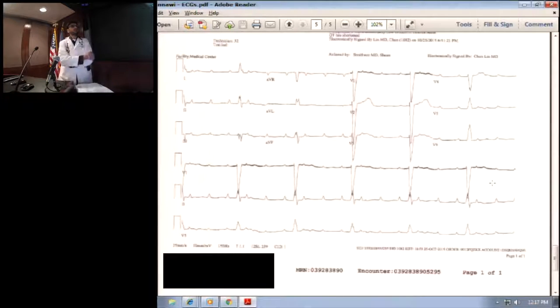And the third thing, let's look at this EKG. It's okay now. Yeah. Okay, perfect. Tell me, what do you see? Who wants to comment on the EKG? Just by looking at it, it looks like you have P waves marching through, and you probably have an escape rhythm, given the fact that it's not perfectly lined up. Perfect. So you're seeing more P waves than QRS complexes, right.